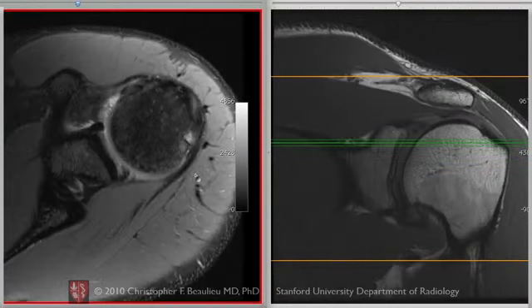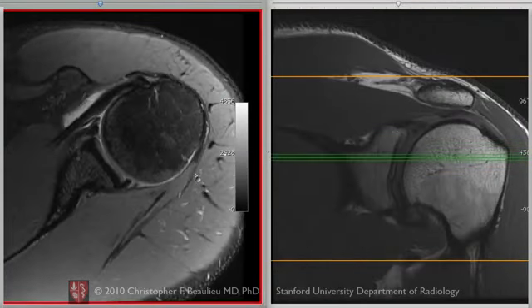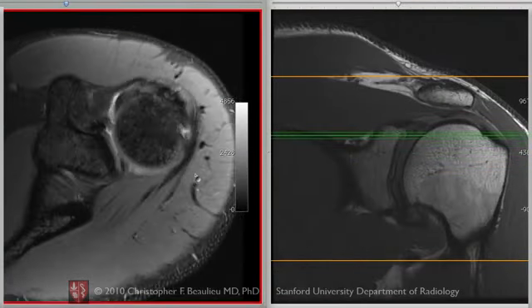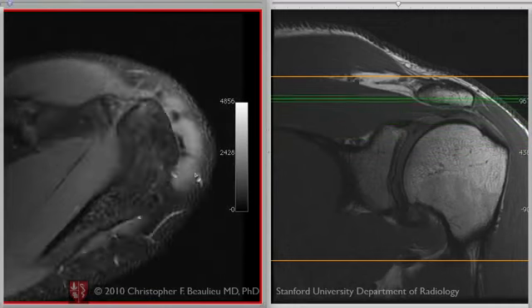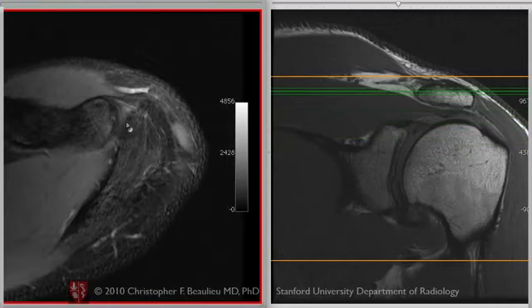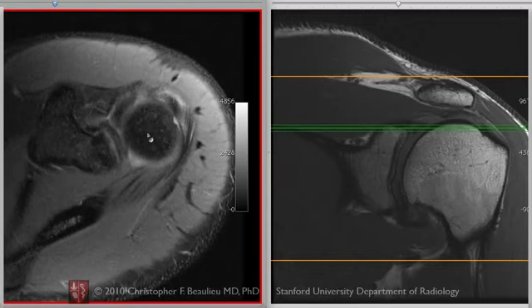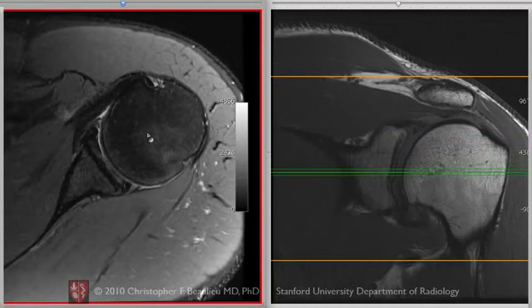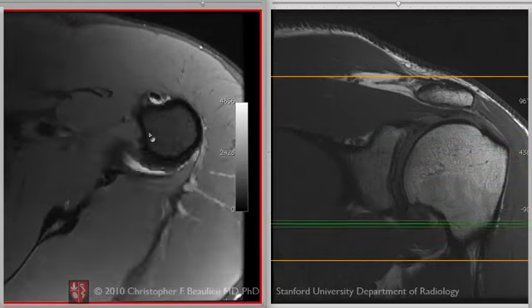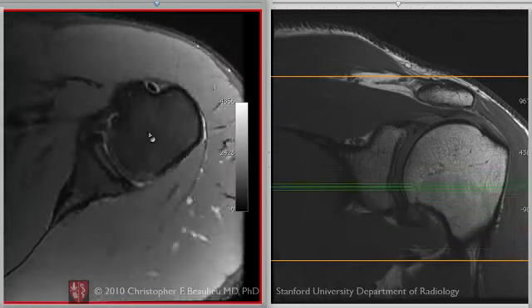As we go to the axial and scroll up and down, you can see the upper sections will go up through the AC joint, shown here, and then we'll come to the upper part of the glenohumeral joint, region of the biceps anchor and superior labrum, and then down into the mid-glenoid region here, glenohumeral joint, down into the axillary pouch.